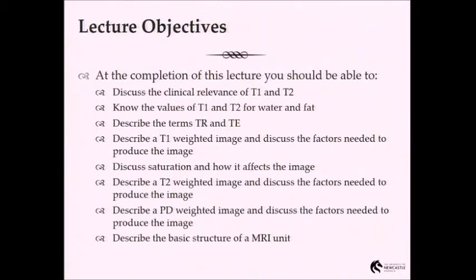I might have mentioned yesterday that one of the things I look at is sport-related concussion, and we use another technique called susceptibility weighted imaging to look for microhemorrhages. The reason is that a certain number of ED departments around the country, if they see someone who suffered a sport-related concussion with a loss of consciousness, will not let them leave the department until they've had some sort of clearing scan. Normally they'll do a CT scan and look for any changes, and if there are none, medico-legally they've cleared them and they're happy for them to go home.